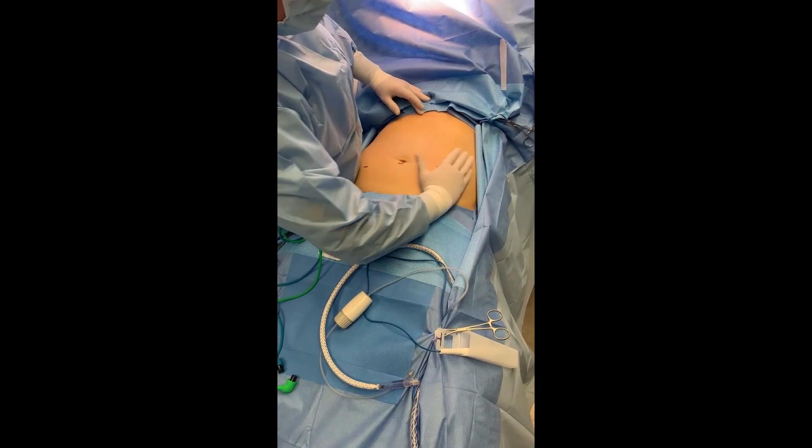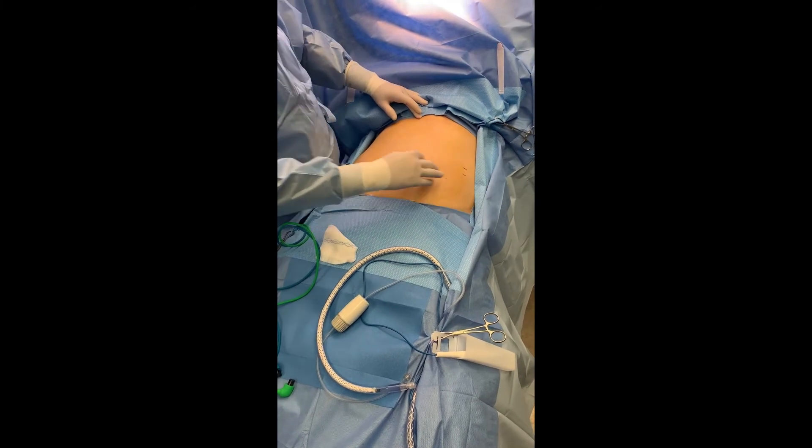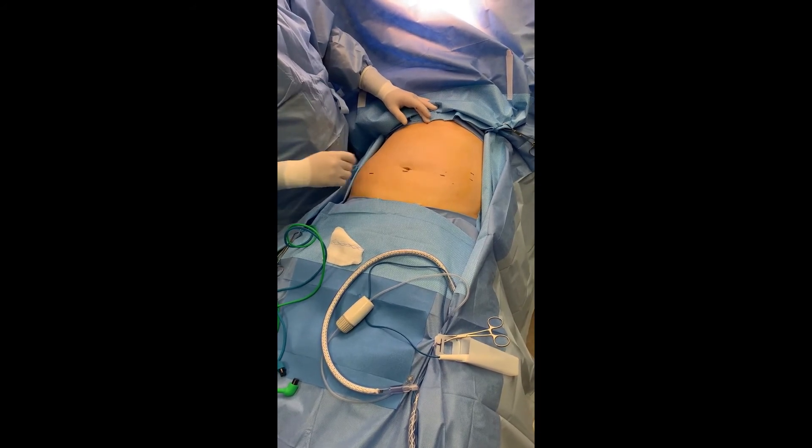Another handbreadth, then one more handbreadth and slightly above, I'll put another 8. So: 8, 8, 12, 12. I'll take the specimen through the midline and close the fascia on the way out.